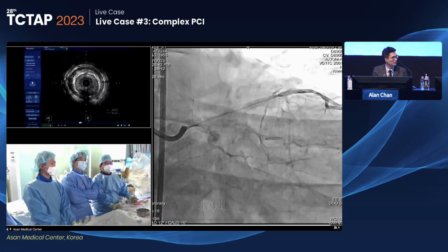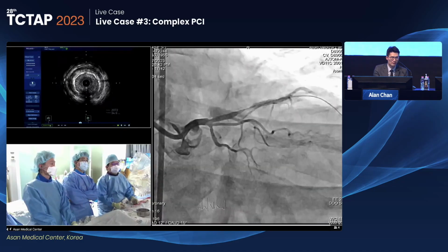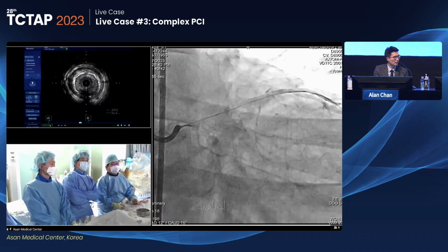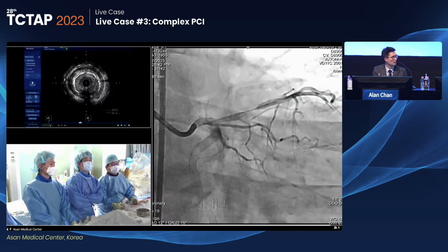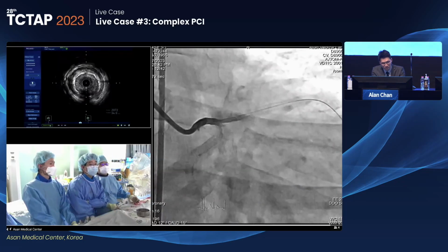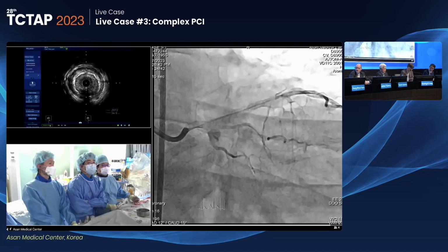So probably the details of the last angiogram, and if possible, any imaging, including intravascular imaging from the last PCI, will be very helpful for us to understand the failure, the quite early late stent failure. And if you only treat the proximal disease, then you don't ruin future bypass targets.